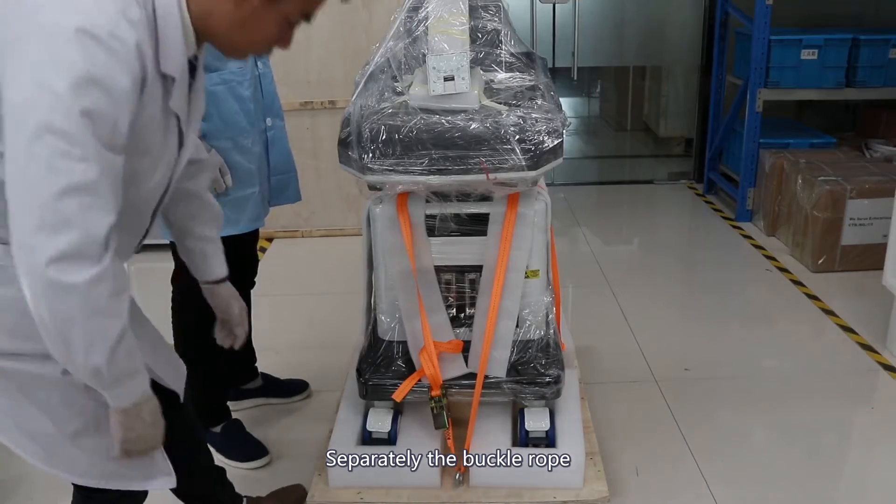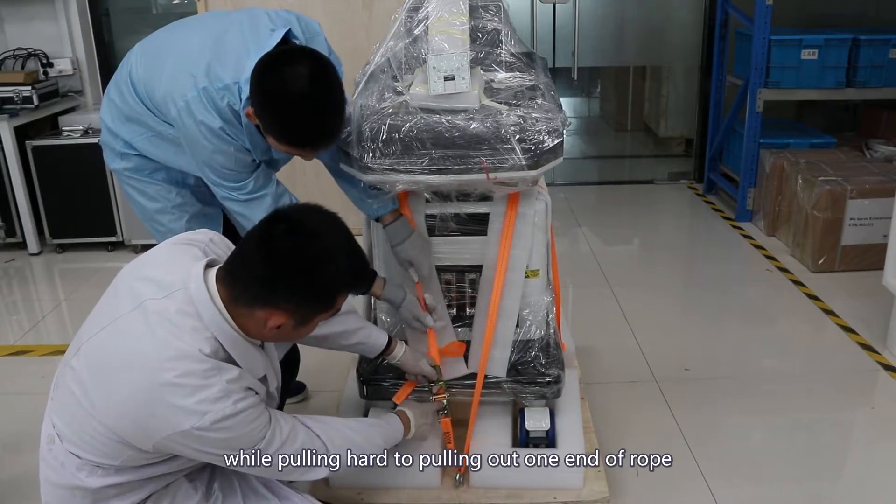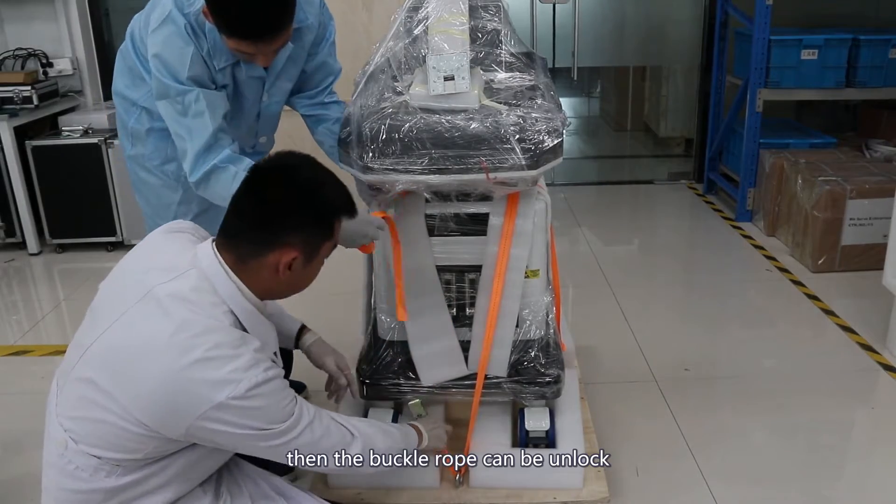Separate the buckle rope. Hold down the buckle with both hands while pulling hard to pull out one end of the rope. Then the buckle rope can be unlocked.